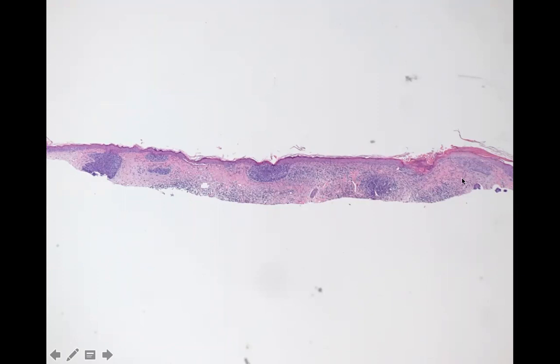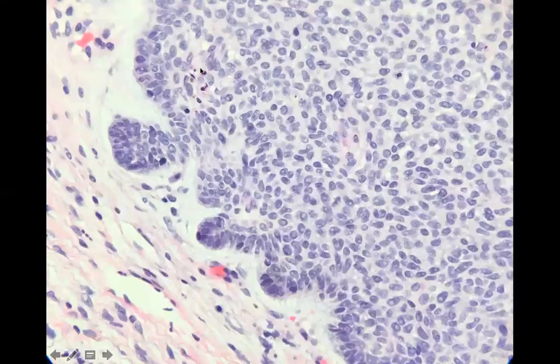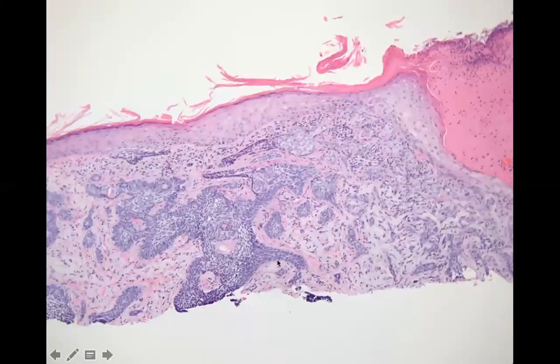And this is a superficial multifocal type basal cell. Here's an up close. You see the myxoid part makes it very loose because of the mucin, right? And because of that mucin being loose, you can cleft in as an artifact basically during processing. Here's an infiltrative basal cell carcinoma. Now you have this change in the collagen that makes these things become these pointy little edges that dive deeper. This is going to be more aggressive than a nodular basal cell carcinoma that's round.